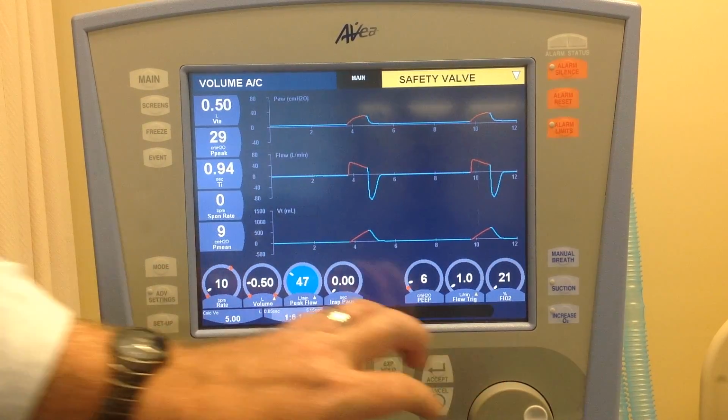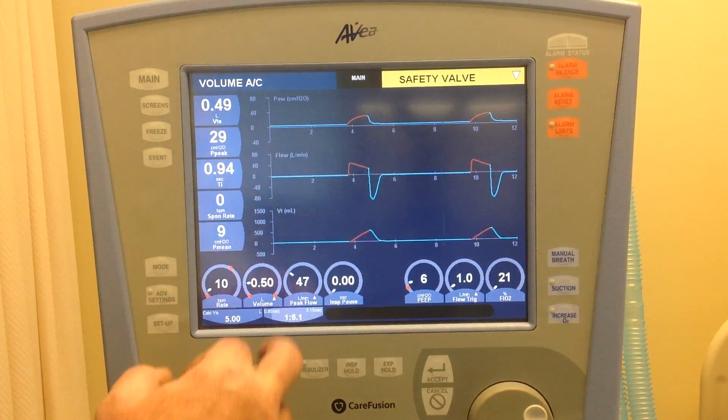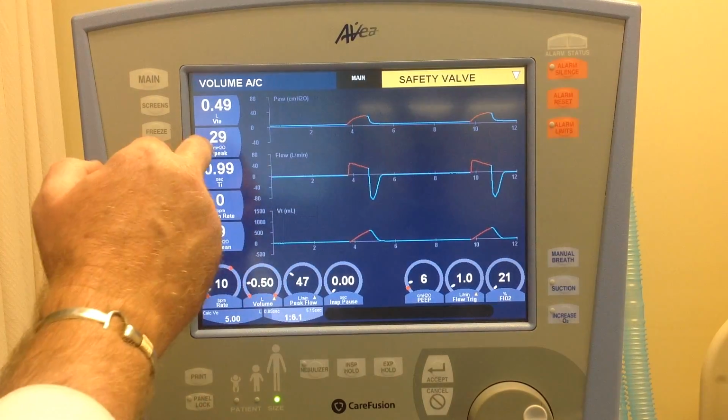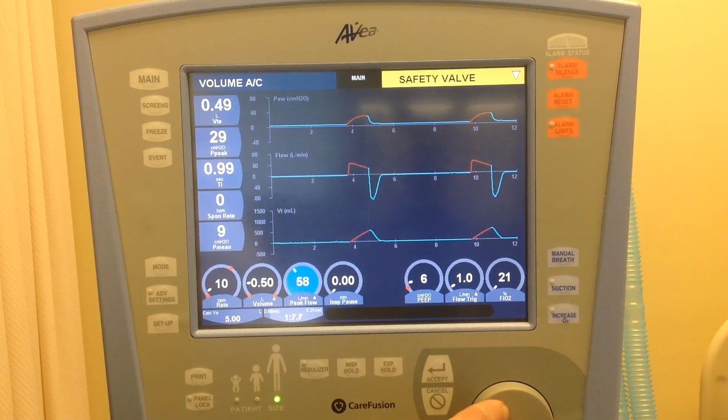Let's try to get it exactly 1 second. .99 close. What happened to my peak pressure? Take it back up to 60.